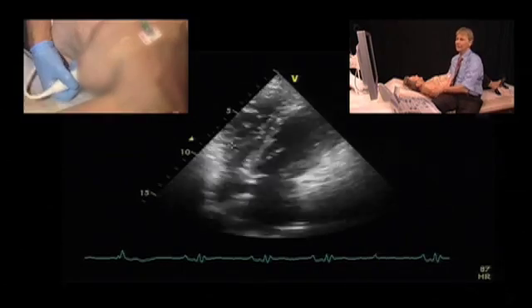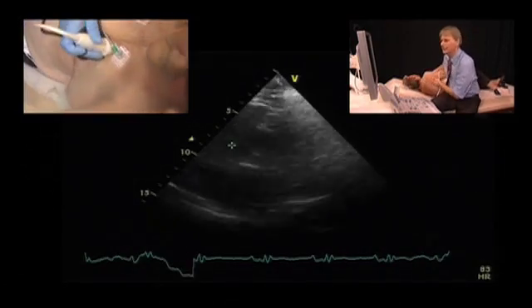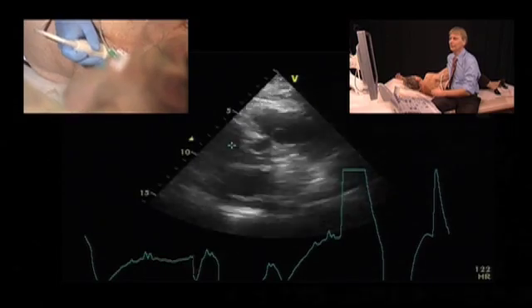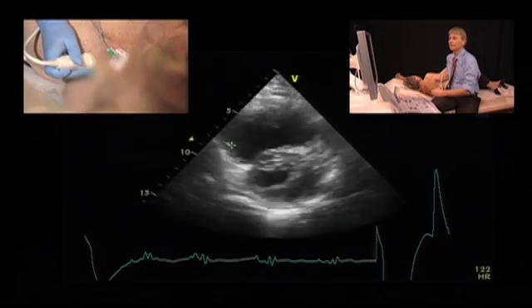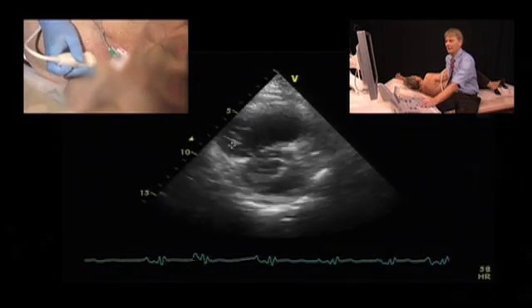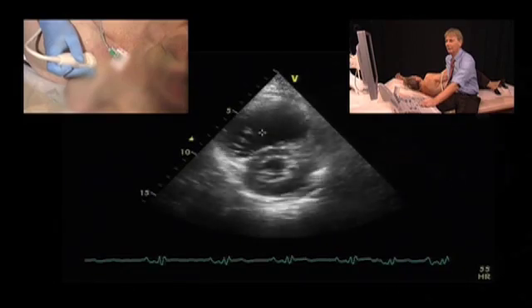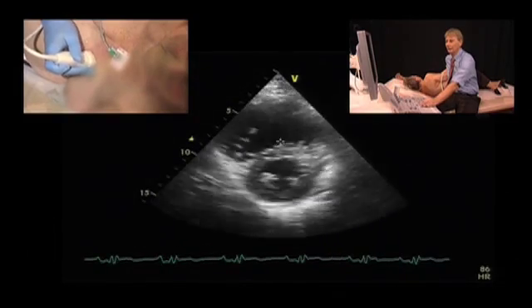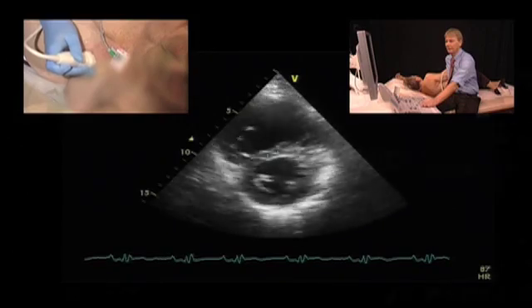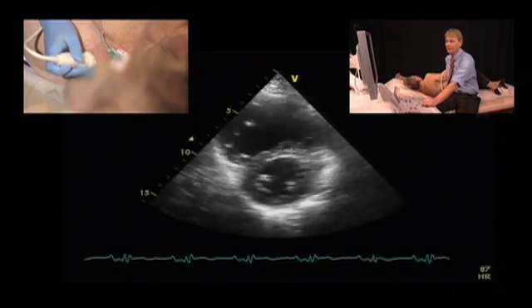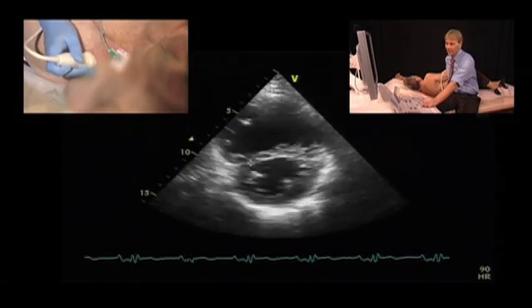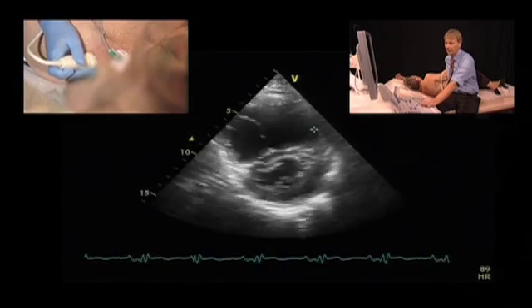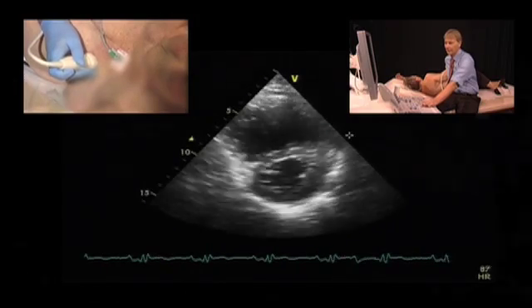Let's now also assess the parasternal short axis view. Again, we see a very small left ventricle, a large right ventricle, and right ventricle hypertrophy. Look at the position of the septum — the ventricle is not round, but there is flattening of the interventricular septum, which is most prominent in systole but also present in diastole.